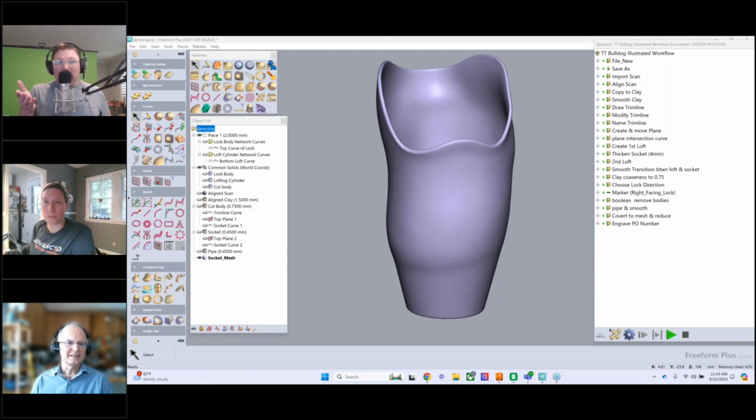Yeah. I mean, I think that's awesome, and I think it's amazing. Literally somebody that is new can then pull that in and they can follow the step-by-step directions.